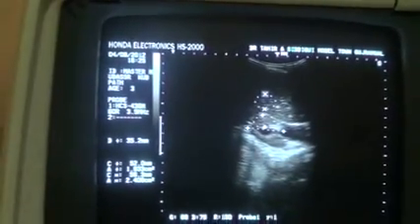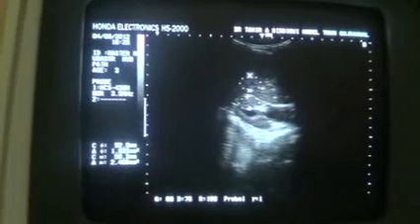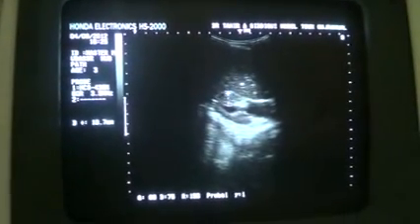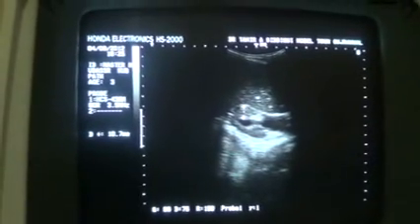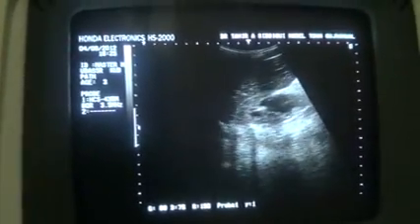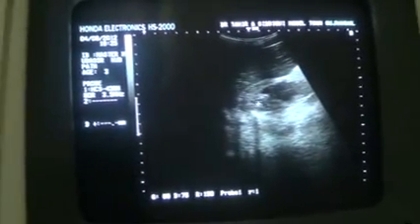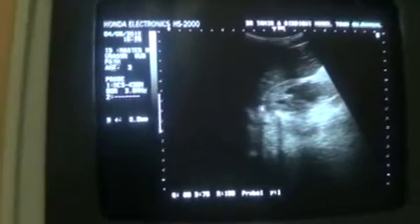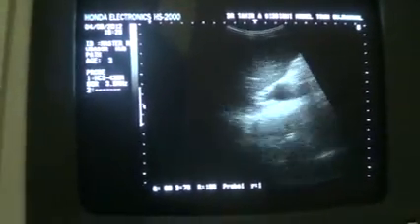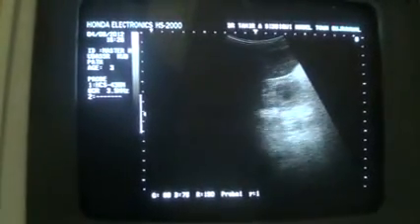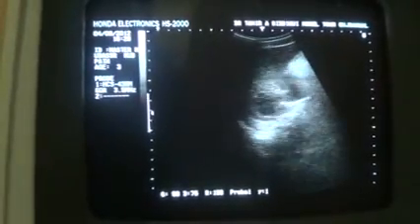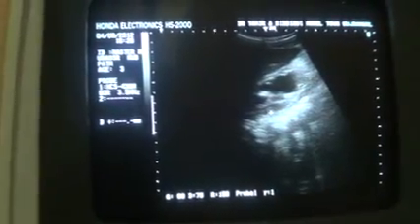He is having renal parenchymal disease. Another thing to appreciate is why his urea and creatinine are now normal — that is because the parenchymal thickness is normal, approximately 10.7 mm. Here you can see the parenchyma and this is the pyramid. Even at the upper pole, the parenchymal thickness may be 14.2 mm. Internally, it shows a moderate to massive degree of hydronephrosis, as all the calyces are dilated.